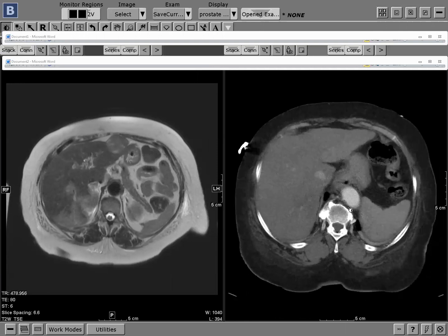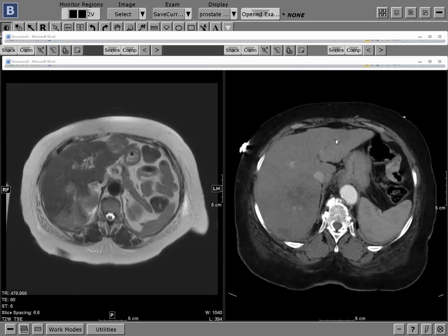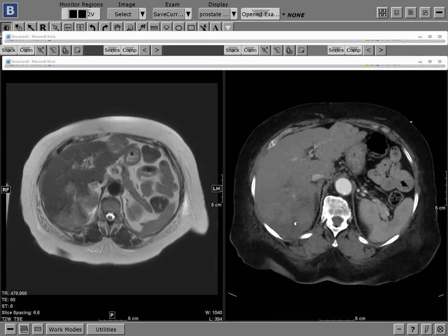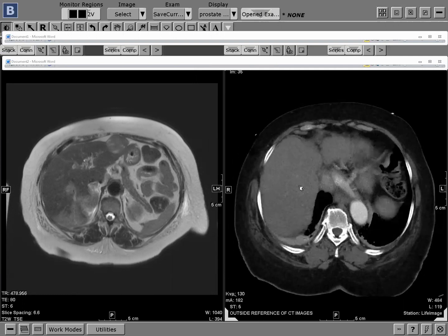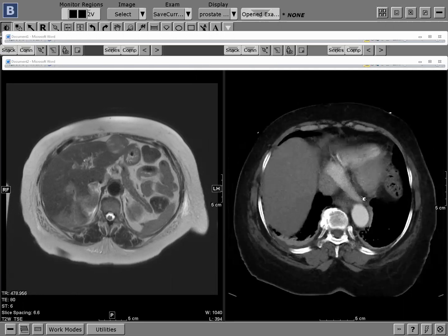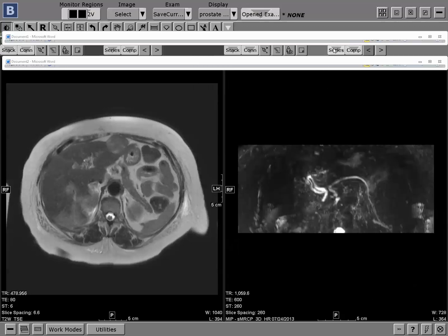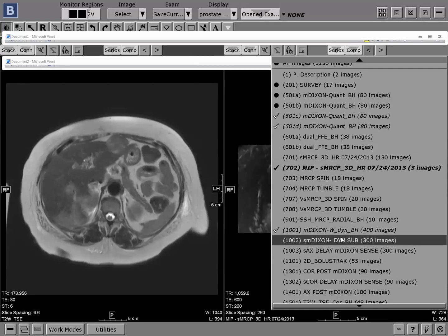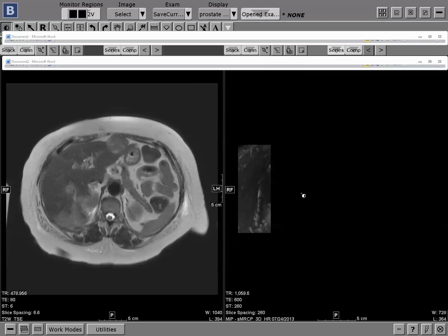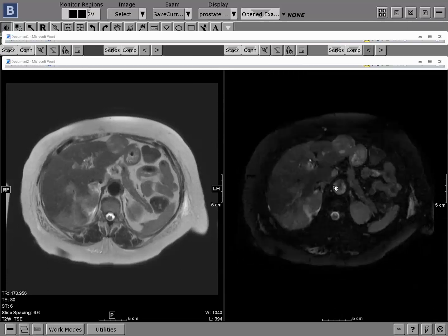And on the imaging, they noticed the liver is cirrhotic, and there's a lesion here, and then some sort of lesions there. So that's how the patient was transferred to us with this big PE and evaluation for liver mass. Okay. So as the patient comes in, of course they're short of breath and not feeling well, and you can see that the patient is breathing all over the place.